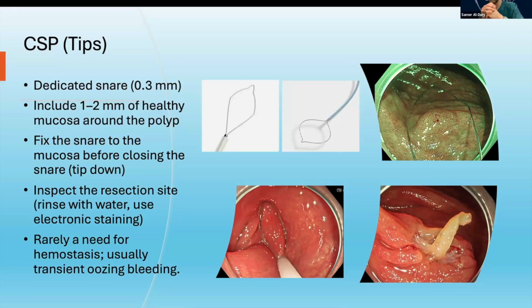We know it's nothing. It's been studied, I think, by the Japanese, where sometimes they say maybe there will be some residual polyp in there, but the consensus is that you don't need to care about it. It's just punched out submucosa, and usually it's very hard to take. Even if you put a snare around that part, it's not easy to cut.